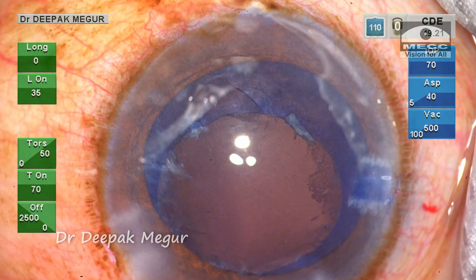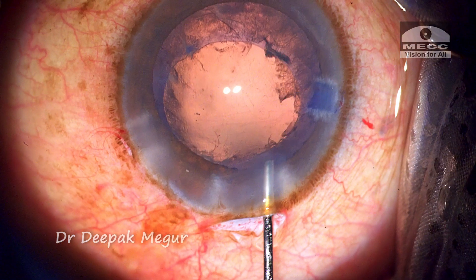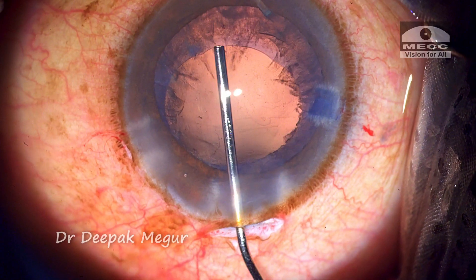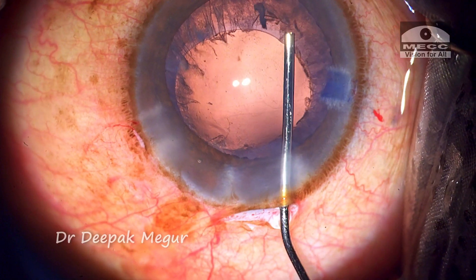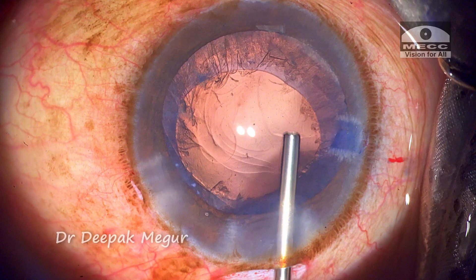As soon as I come out, we can see the entire capsule bag complex move forward. I should have injected OVD into the eye before coming out. I try to clean up the capsule by irrigating with BSS, then the capsular bag is deepened with viscoelastic before cortex aspiration is gently begun.